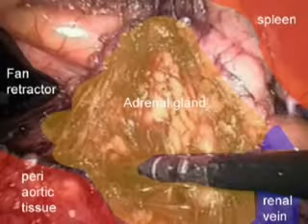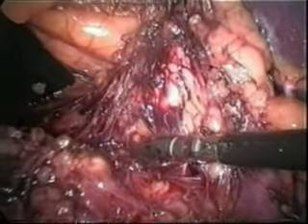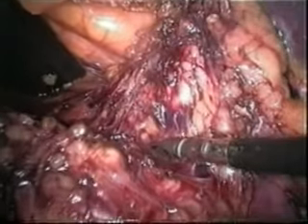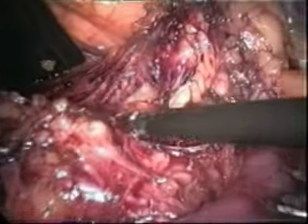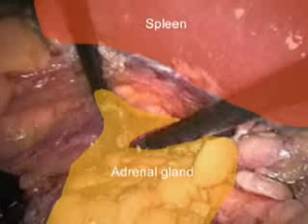We now expose the dorsal surface of the adrenal gland. This anatomic outline shows the main structures to be considered during this part of the operation. The bipolar dissector is used to coagulate and divide the superior suprarenal arteries. Note the pulsation of the aorta in the lower left part of the image. Subsequently, the cranial dissection of the adrenal gland is performed. The anatomic structures are shown in this image.